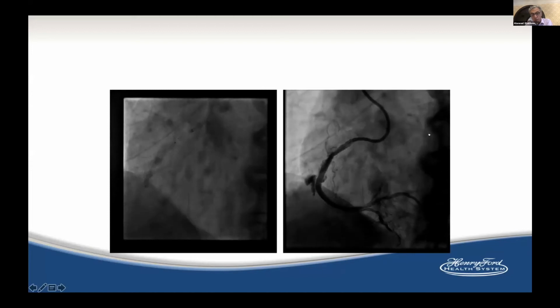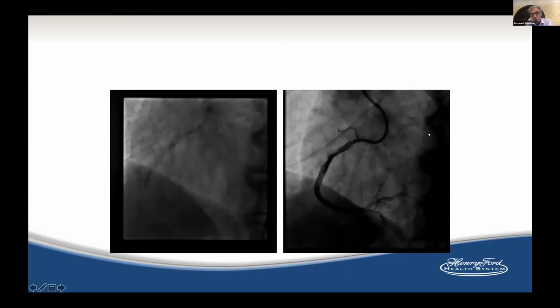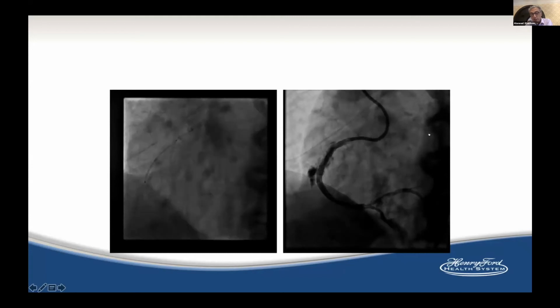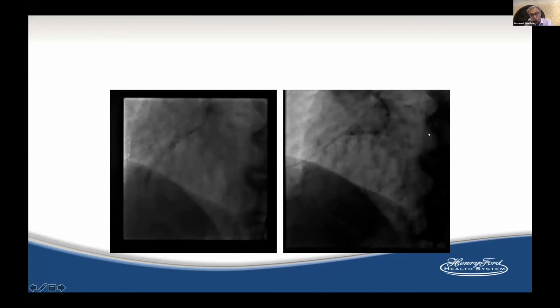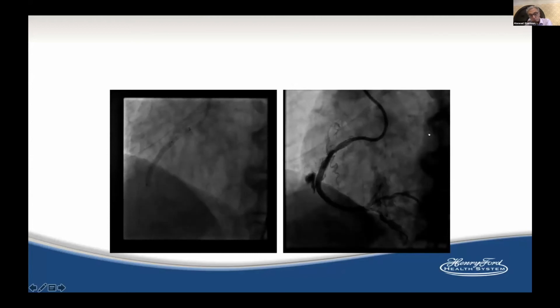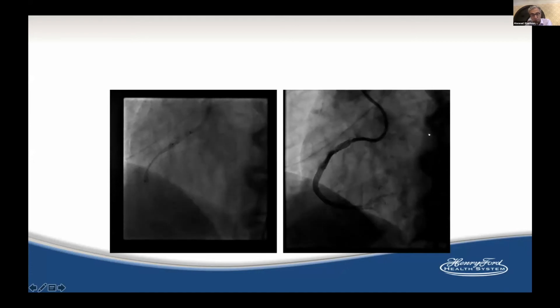And you have to have the tools available to you in the cath lab. Your cath lab staff need to know where these tools are, so you don't go scrambling for them. And I would suggest, like Bill Lombardi always suggested, while you're doing a procedure, in the middle of the case, stop and ask your staff to bring you the pericardiocentesis tray and to give you a covered stent. You need to make sure that these tools are going to be in your lab within 1 to 2 minutes. Otherwise you have to sit back and train your staff again.